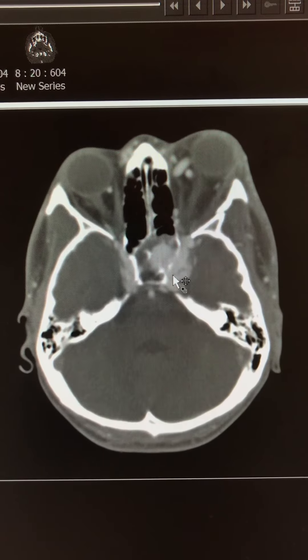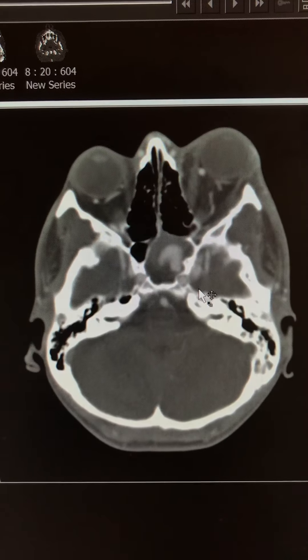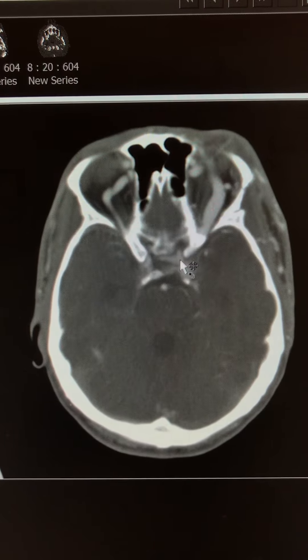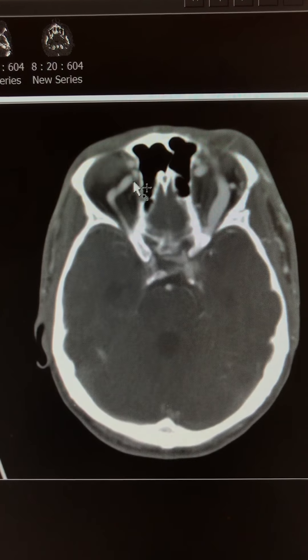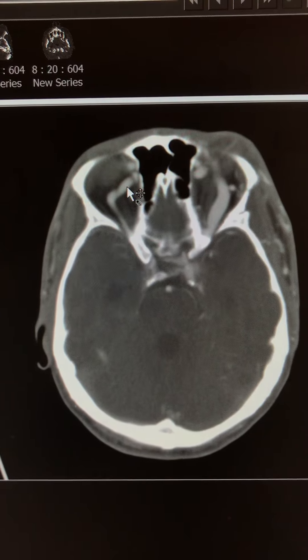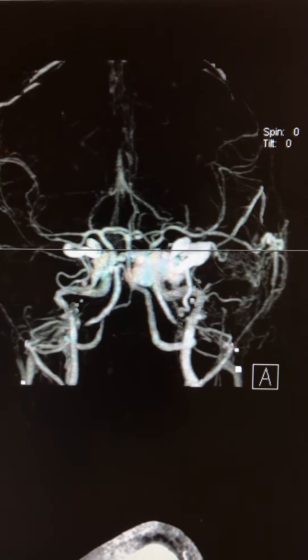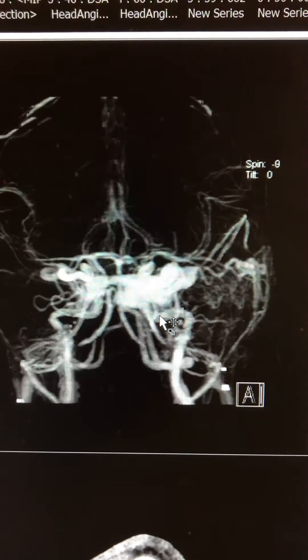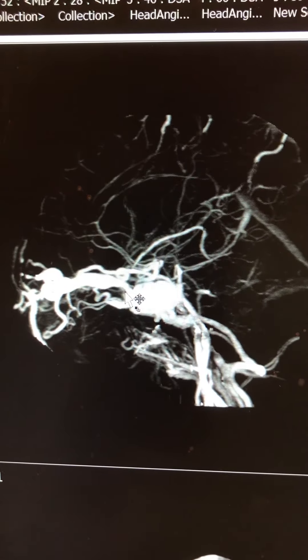You see the communications between the carotid artery and the cavernous sinus — very dilated, multifocal communication. Sometimes you actually see this crossing to the other side, as seen here, and you also see increased pressure and dilation of the superior ophthalmic vein on the right side. The CT angiogram at the time confirmed this carotid cavernous fistula, showing these communications and markedly dilated vessels on the lateral view.